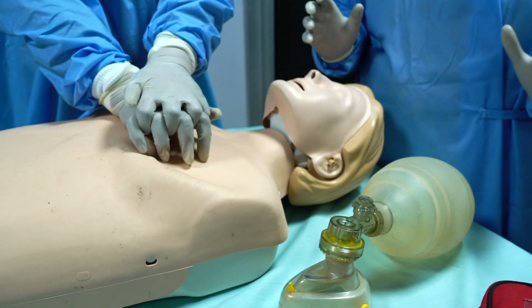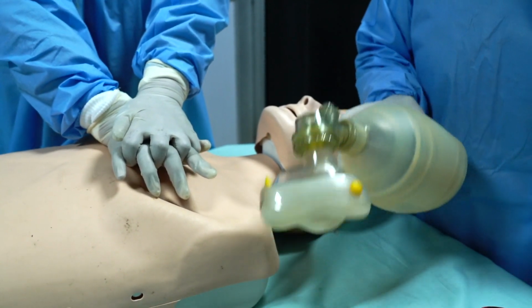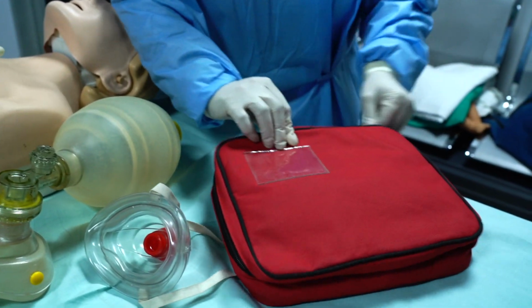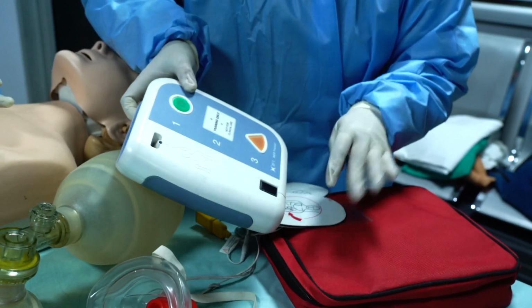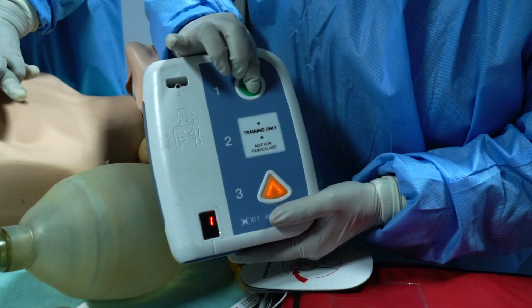Now the second rescuer has come. The first rescuer will continue chest compression. The second rescuer will come with the AED and ambu bag. So he will just take out the AED from the bag. Then, the first step is to turn the AED on.